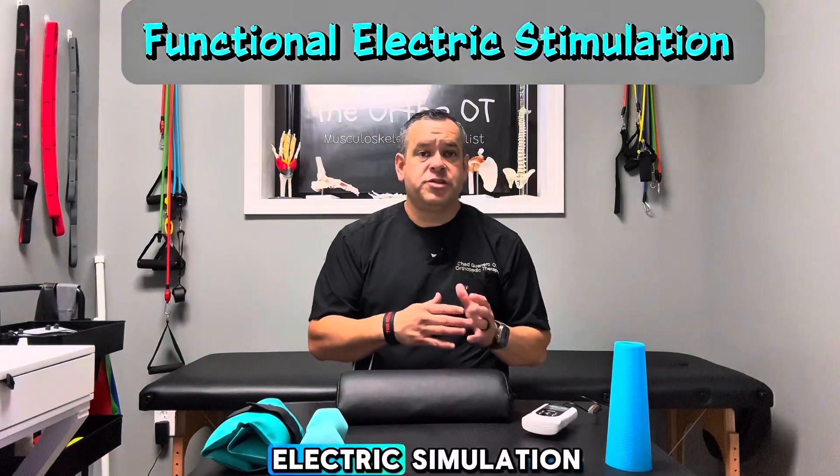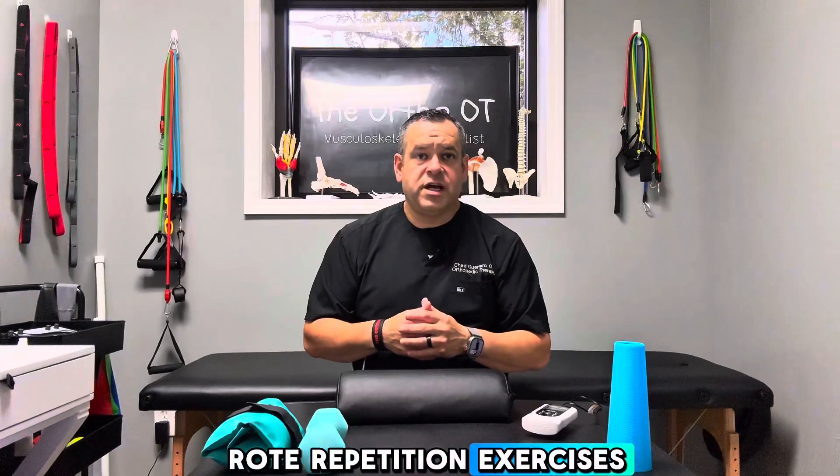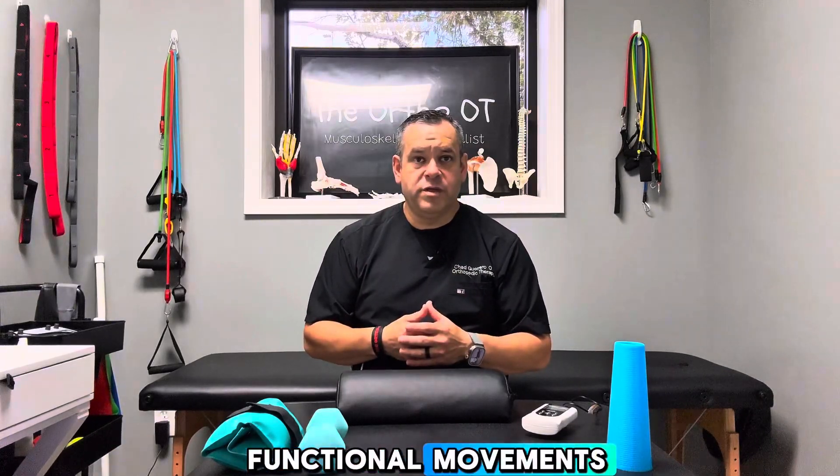In this video I'm going to go over using electric stimulation during static sitting, rote repetition exercises, and then some simulated functional movements.